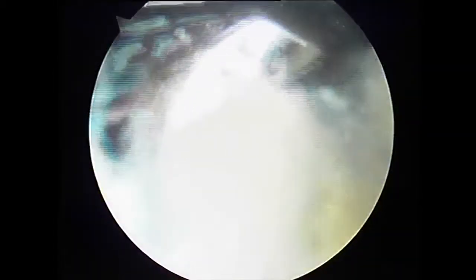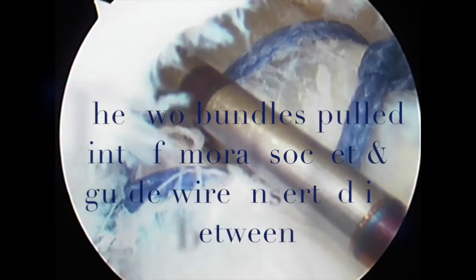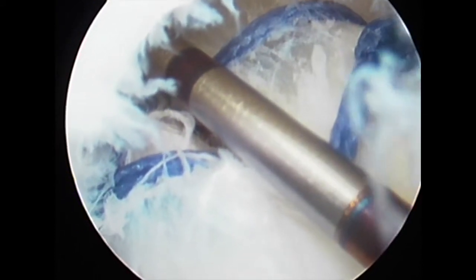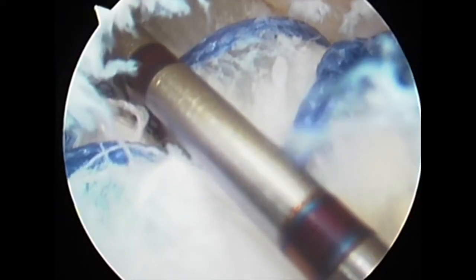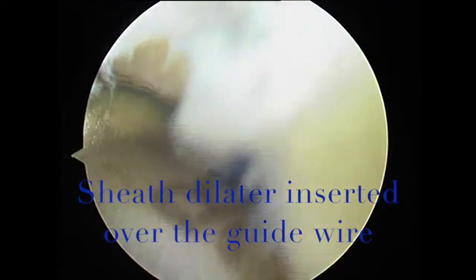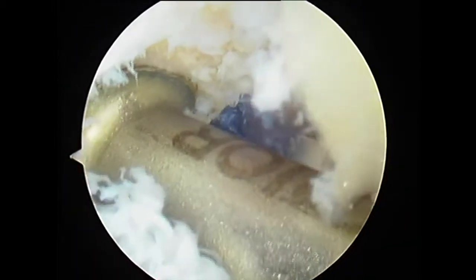A tibial reamer then follows the drill pin to create a tibial tunnel that matches the size of the graft. Now the graft is pulled into position and we can see that the shape of the graft is like two bundles that replicates the anatomic arrangement of the anterior cruciate ligament — an anteromedial and posterolateral bundle. A guide wire is driven between the two bundles, then a sheath dilator is inserted, and we see a laser mark that tells us where to stop.